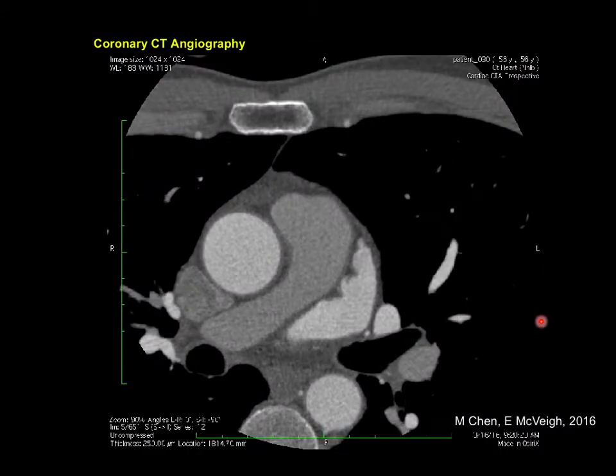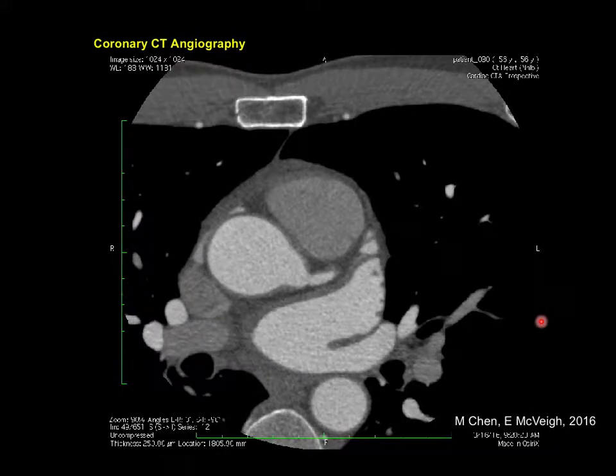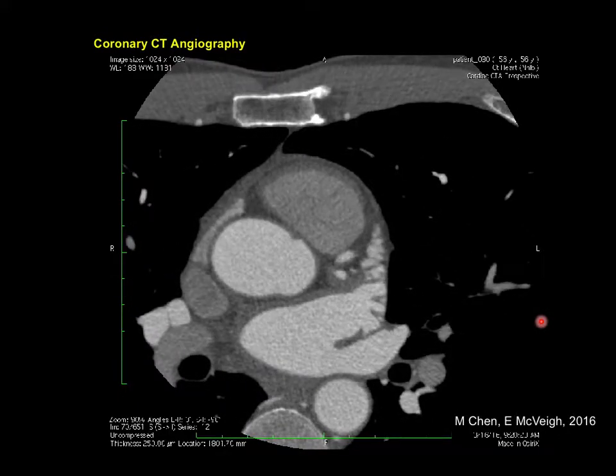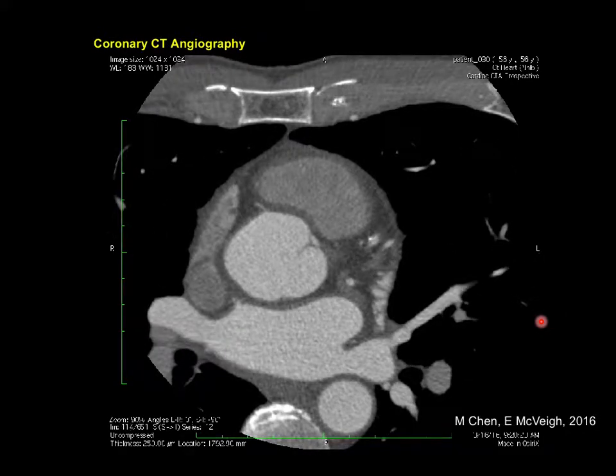So that's another issue: there's almost too much data, because it takes so long to drive through all of it in great detail. And there's just becoming more data.